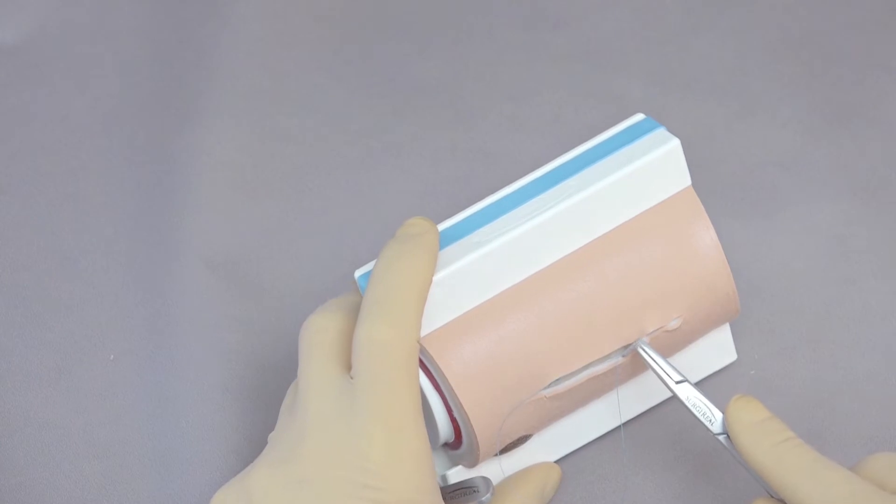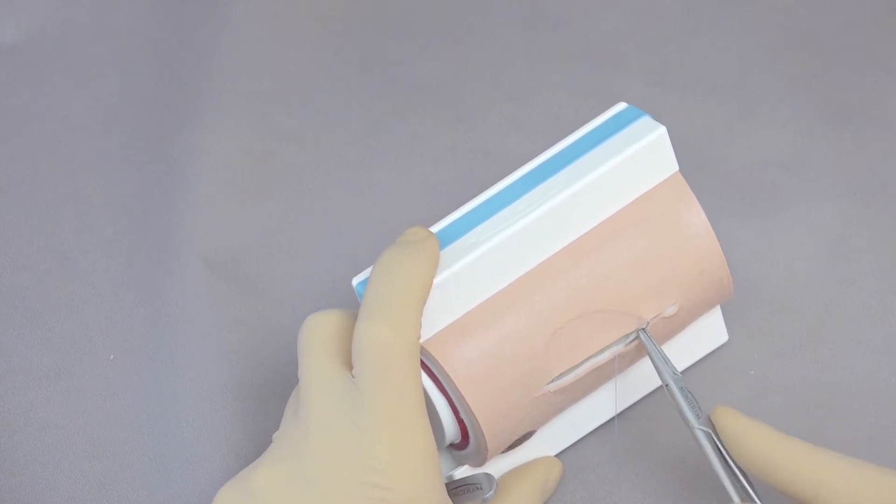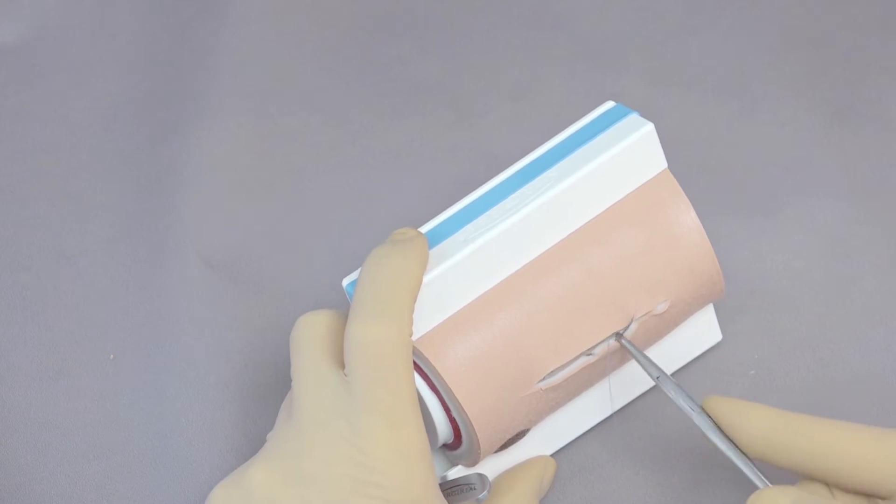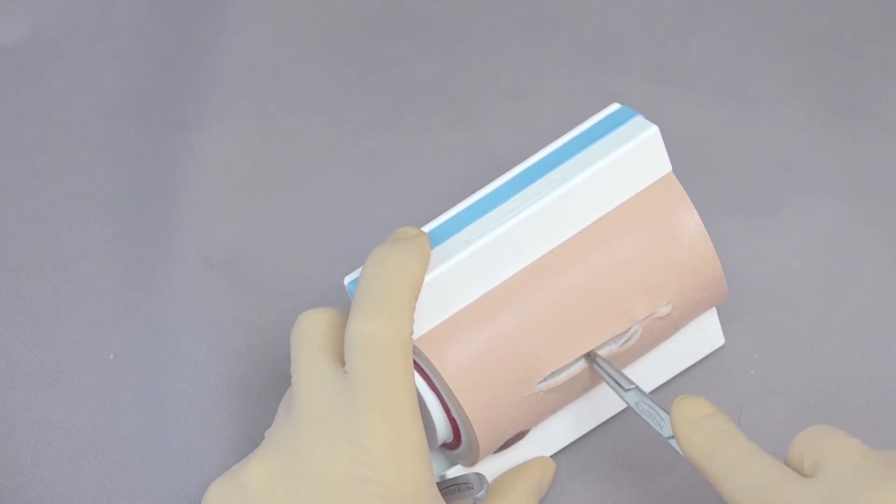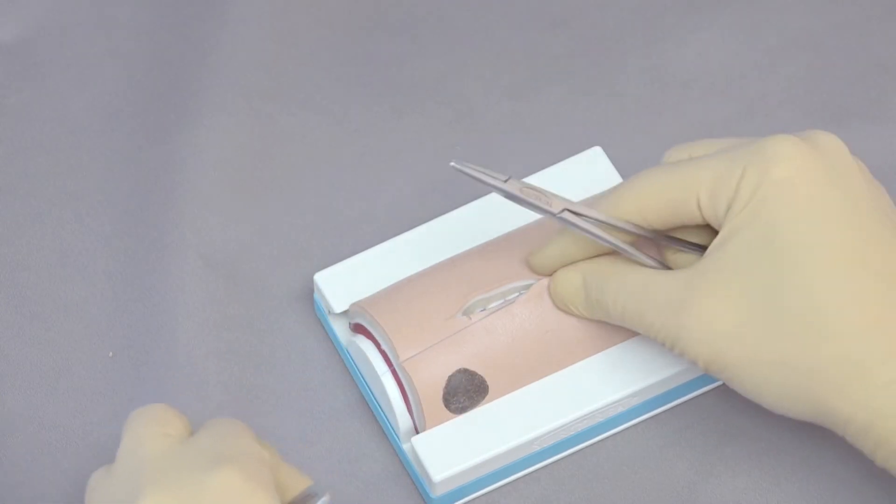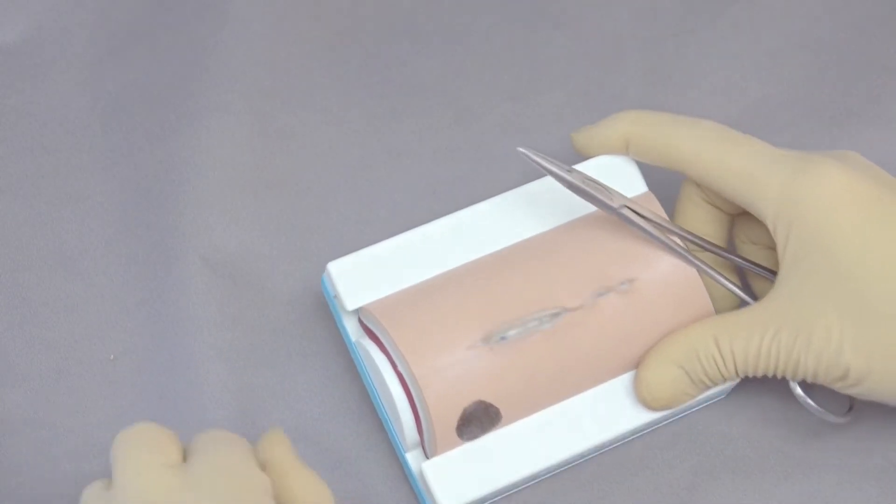So now I'm going to try to be better coming right at that junction, not taking too far of a suture bite, come right up at the junction. And as I do that, you can see how I'm opposing that skin really nicely.